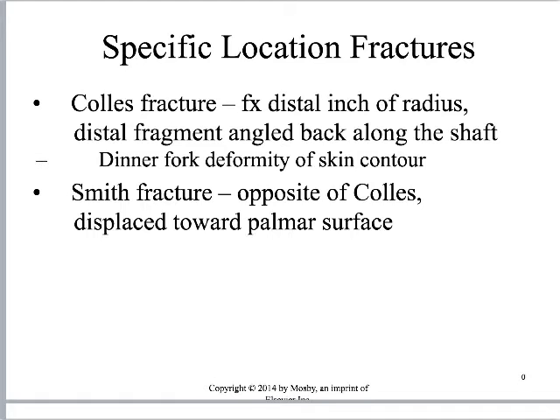All right, some of us have written papers on these, but it is helpful to review them. I have seen registry questions that ask us specifically about each one of these, and part of it is it allows us to think about bony anatomy, mechanisms of injury, and how that would impact the bony anatomy. So we'll be looking at images of these for the activity today as well. I will be asking you to describe what you're seeing on the images, okay?